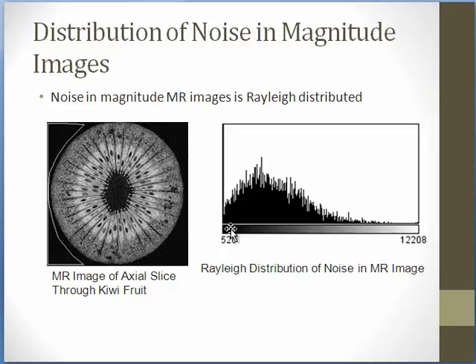So here I'm showing a histogram of the pixels in the white region, part of the noise region, not the entire noise, because obviously there's noise over here as well. But it indicates this distribution. If we had a Gaussian distribution, we would have something like this, going up and down, and Gaussian would have a zero mean. But here you can see there's a much different distribution.